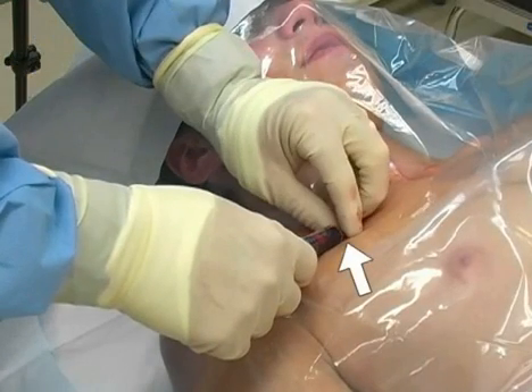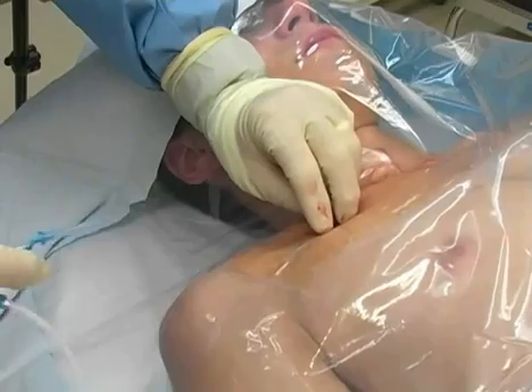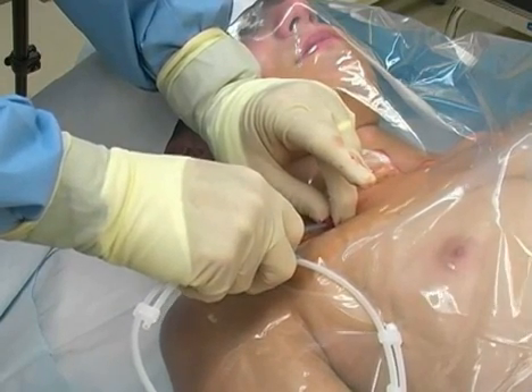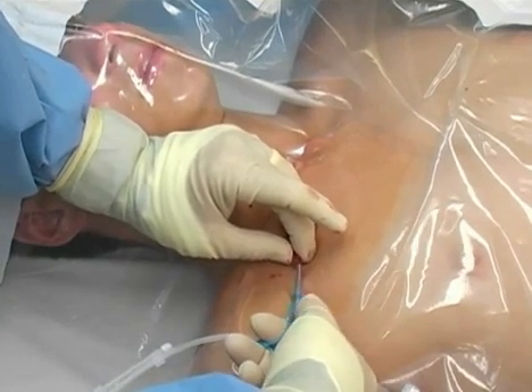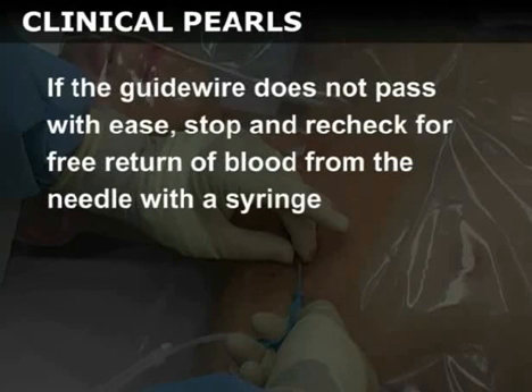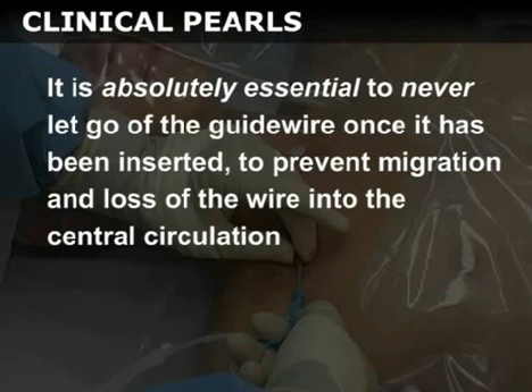Once the vessel has been entered, secure the hub of the needle with your non-dominant hand, taking care not to advance or withdraw the needle. Remove the syringe and immediately occlude the hub with your finger to prevent air embolism. Next, insert the tip of the guide wire straightener sleeve into the hub and begin to advance the wire into the vessel with the thumb of your dominant hand. In general, no more than 15 cm of wire should be inserted to avoid advancing the wire into the heart. Some guide wires have markings every 10 cm along the wire to assist with estimation of depth of insertion. If the guide wire does not pass with ease, stop and recheck for free return of blood from the needle with a syringe. If you are having trouble advancing the guide wire, withdraw it slightly, rotate it a bit, and try to re-advance. It is absolutely essential to never let go of the guide wire once it has been inserted, to prevent migration and loss of the wire into the central circulation.